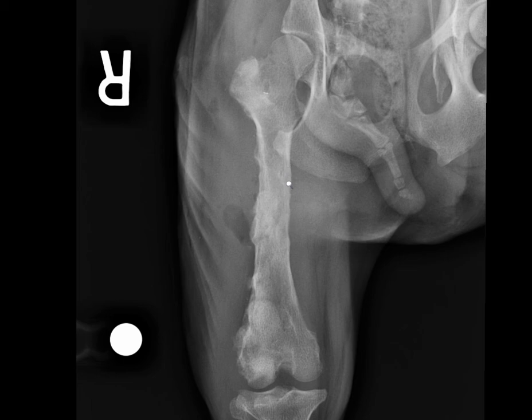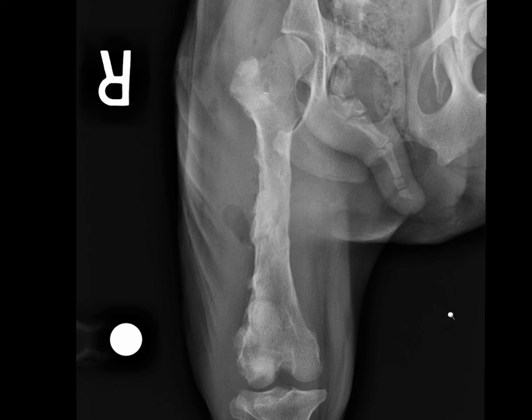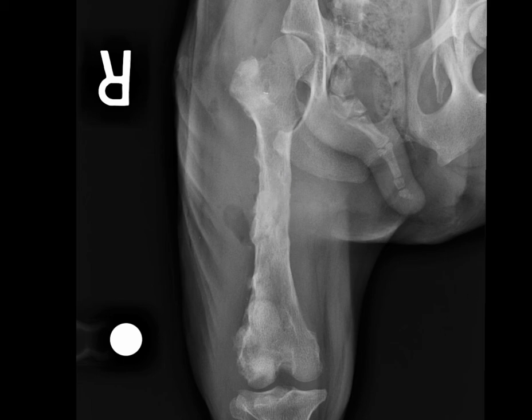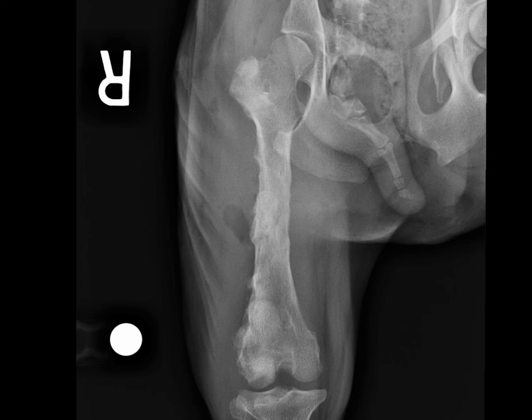You can see that the cortex of the bone does remain fairly thin and isn't entirely smooth just yet. Be sure to review the full report associated with this case. Thanks for listening, and remember — it's your case, so please post your questions on social media.